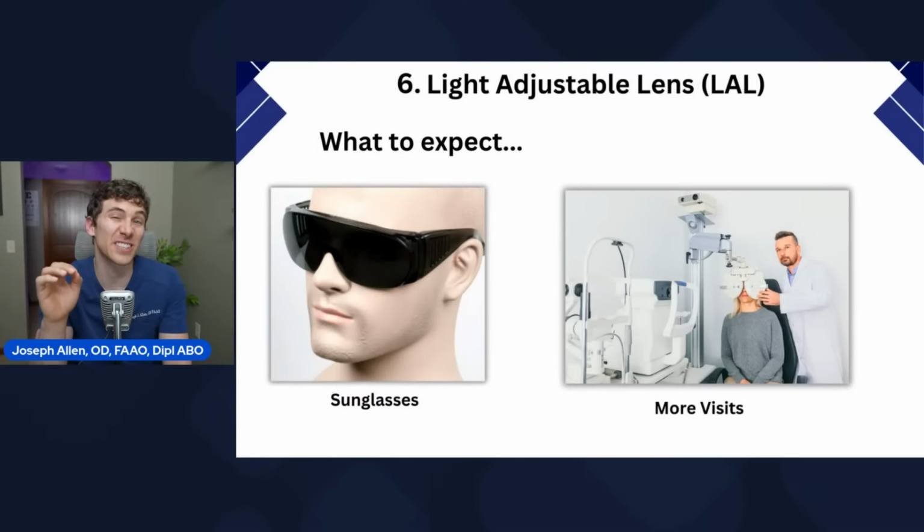And you want to expect that it's going to take many more visits seeing your doctor, because there's just a couple more times we need you to come in so we can figure out the glasses prescription, dial it into the instrument, activate the light, get it to slowly change until it's just right, and then we can lock it into place.